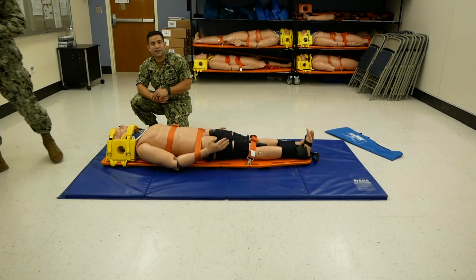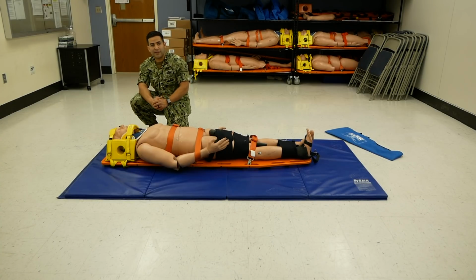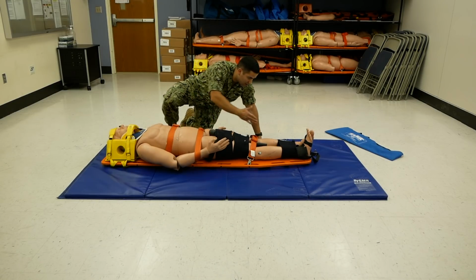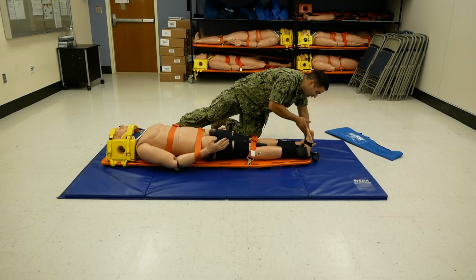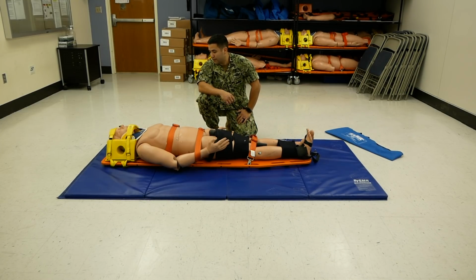After you have done this, you want to go ahead and reassess the patient, redo primary and secondary assessments, check vital signs, reassess your interventions, make sure the traction splint is still applying traction, document, and send up that MIS report.